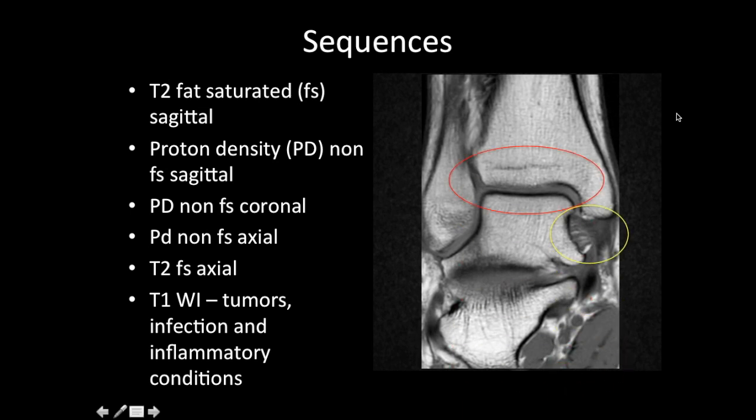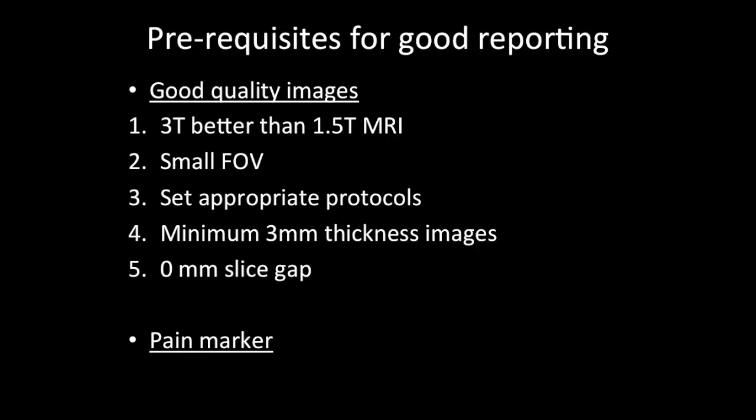Precisely because, as you can see, the cartilage is not well seen on T1 images. Also, the ligaments have poor resolution and it is difficult to identify ligament injuries on T1-weighted images.